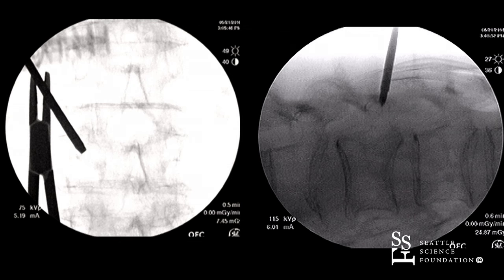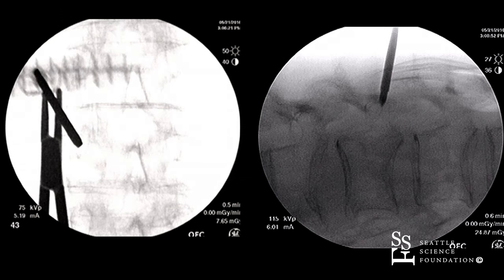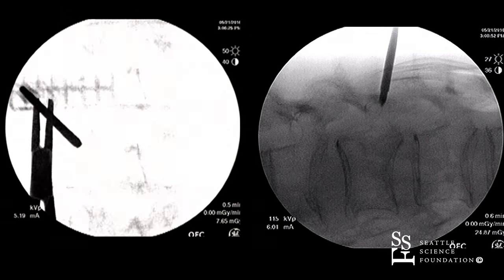As you can see on the oblique view, it's coming close to the medial cortex — which you want to stay away from, especially before hitting the posterior cortex of the vertebral body on the lateral. So I want more of a down-the-pedicle approach.